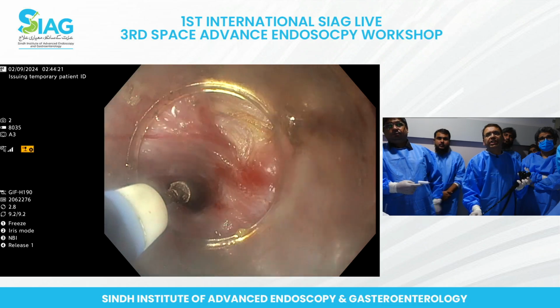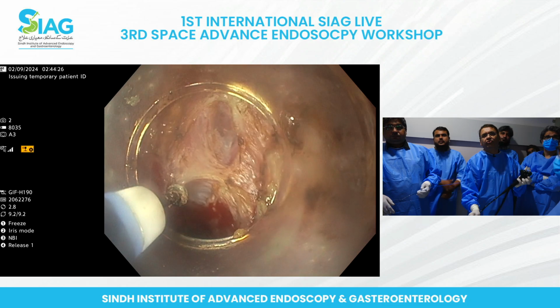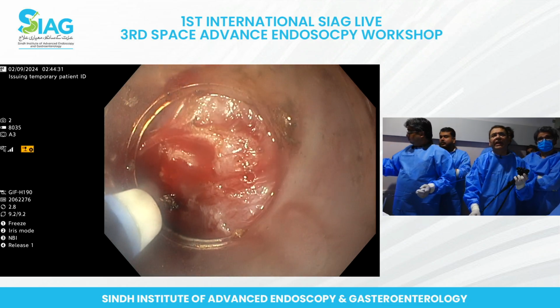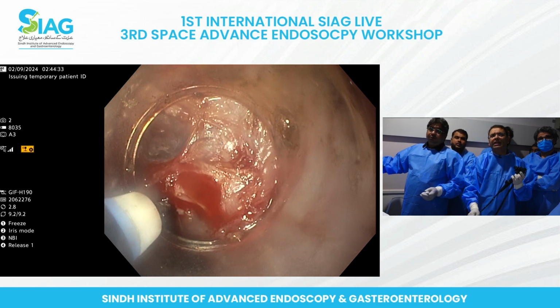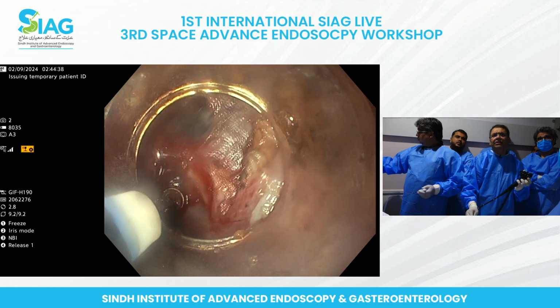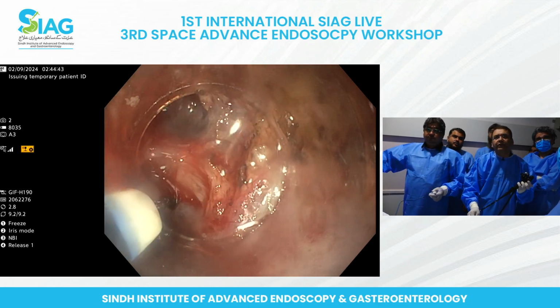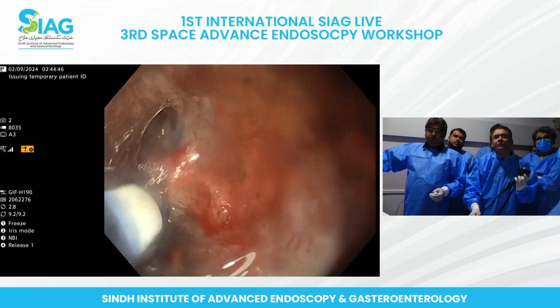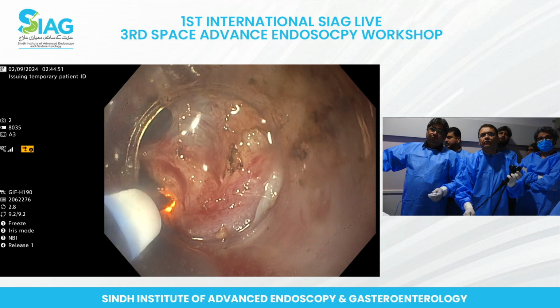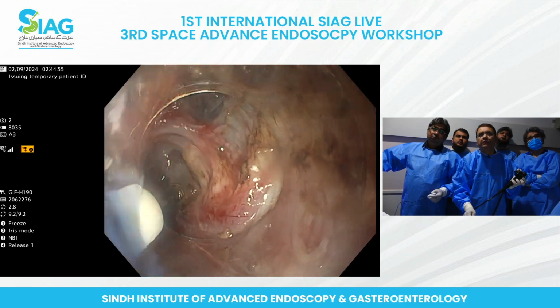So this is the GE junction right here. Yes, Khalid, we can see that. Sometimes it bleeds in that area, which is okay. There was a vessel, I should have been a little bit more careful, but yeah, go ahead. Dry cut. If this doesn't work, we can always use a coag grasper, so that should be okay. I think we're okay.